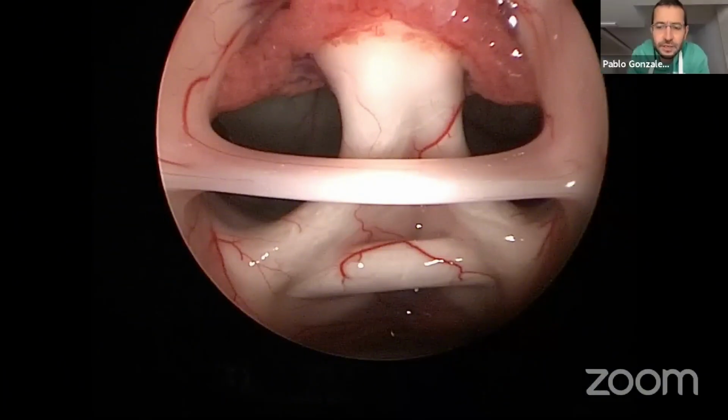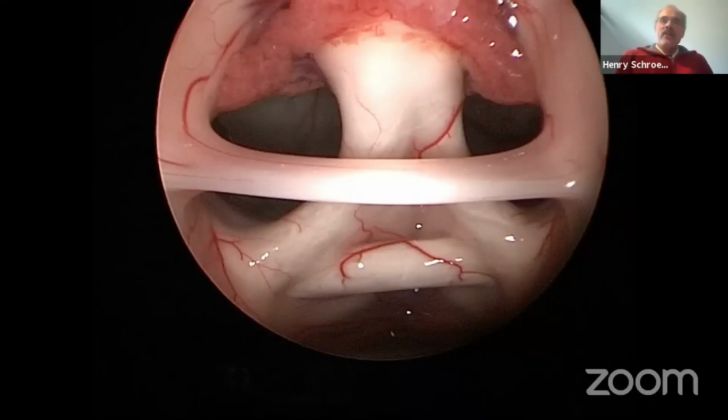And we have one more question. How do you manage patients who have small ventricles? Is it a good indication for an endoscopic approach? If I have a tumor in small ventricles, I usually do a transcallosal approach. If I have a patient with slit ventricles who has problems with a shunt, we occlude the shunt, dilate the ventricles a little bit, and then go in with neuronavigation. Sometimes we take biopsies from tumors in normal-sized ventricles, not very narrow, and with navigation it's a very safe procedure. But with slit ventricles, I think the endoscope is not the best choice in many cases.